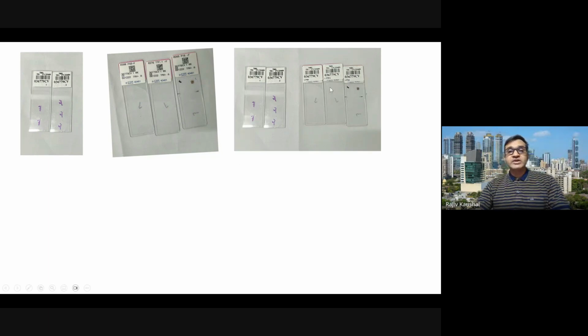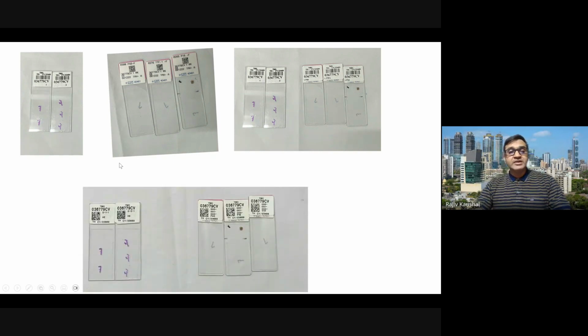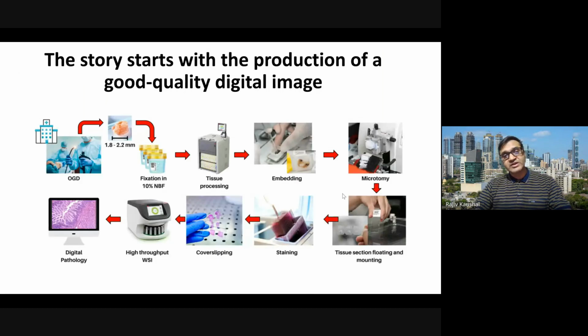So we initially used a jugaad method, where we put some additional stickers on these slides so that they all can come together. But in the end, the aim is to have uniform sticker barcodes, where you can avoid putting additional work on your laboratory staff, and it also reduces the failure rates. So this was in brief the background about the setup of digital solutions.